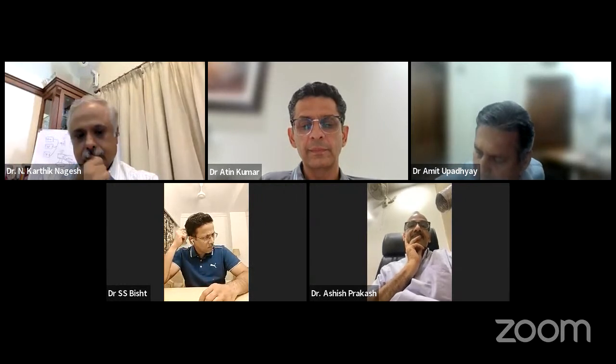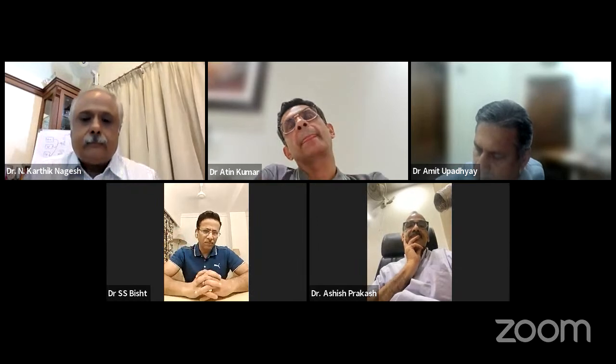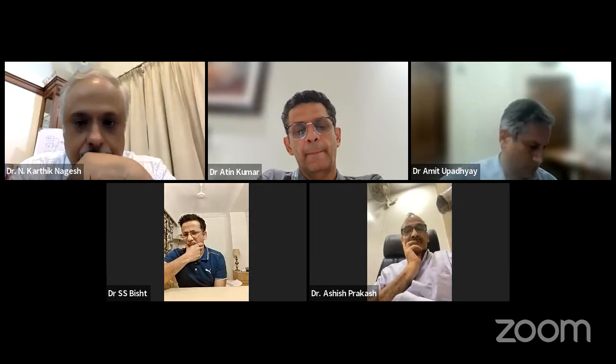Mangla, you wanted to ask something? Yes, sir, I think we discussed a lot about the timing of a scan in HIE. So we'd like to have your opinion about the ideal timing in the other two common forms of injury we see, hypoglycemic brain injury, especially because that's an area where it's always difficult to exactly identify the timing of insult, unlike HIE. It could have happened at any time. So if you're suspecting a hypoglycemic injury, what will be the right time, sir, to do a scan to pick up the injury?